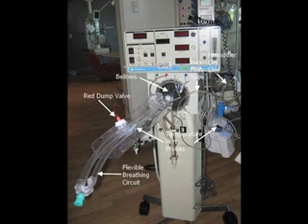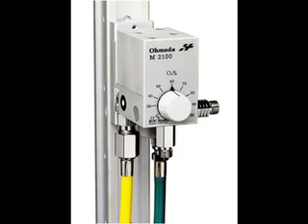The FiO2 is set. It's hard to tell in this picture. I'll show you another. The blender, of course, is connected to both air and oxygen, is located on the bottom left of the oscillator, and is used to control your FiO2.